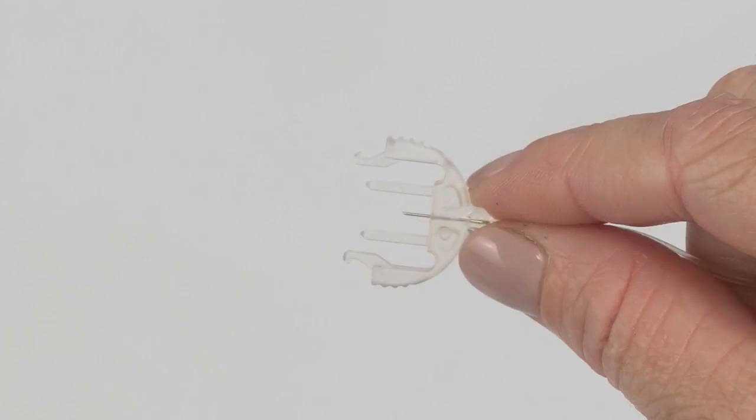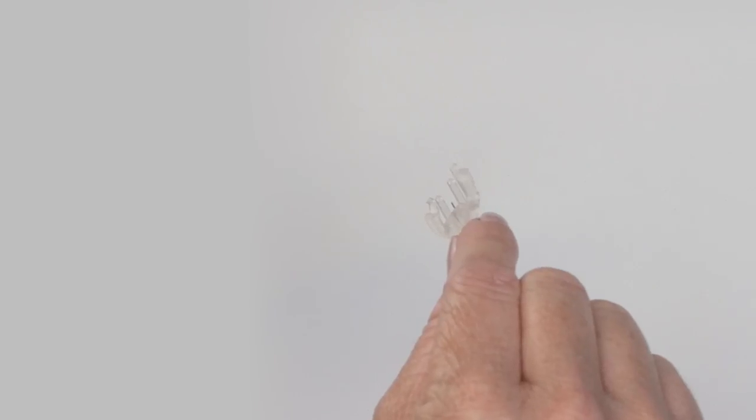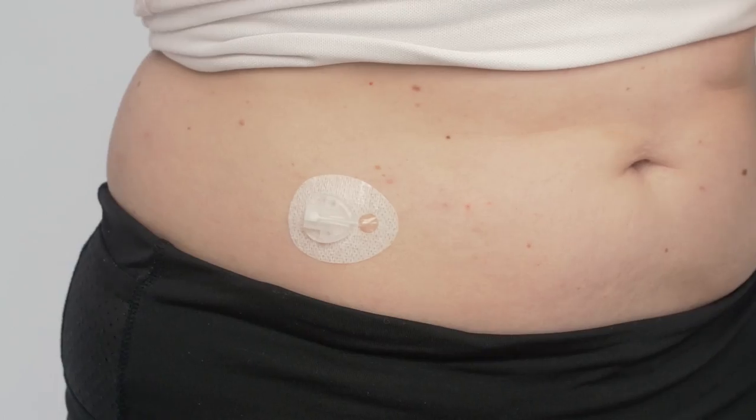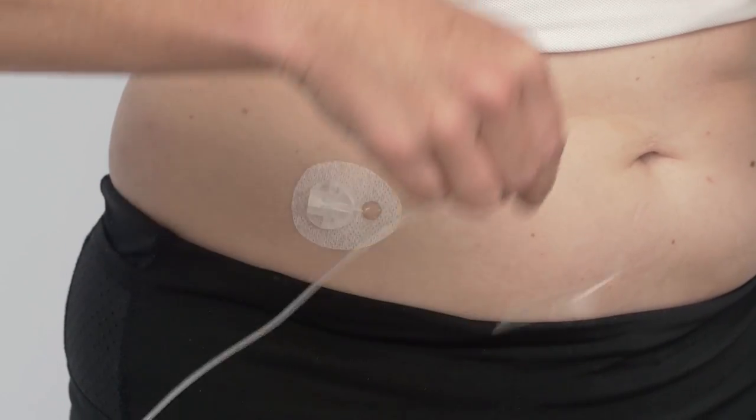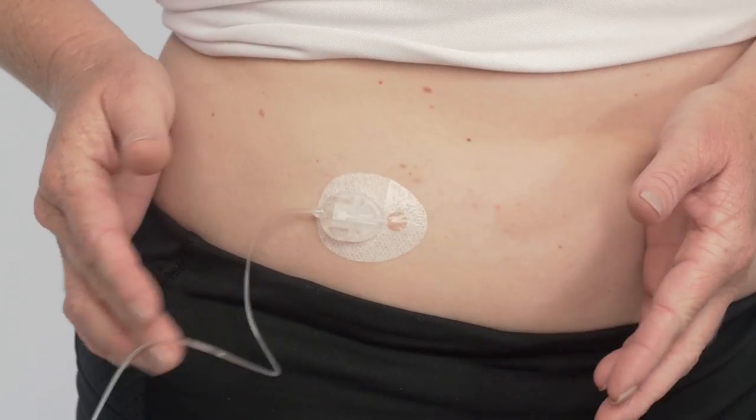Next, connect your filled tubing to your infusion set by holding the connector needle at the point where it connects with the tubing. Be sure you have the connector needle right side up to properly connect to the site. Insert it into the cannula housing. You should hear a click when it connects.